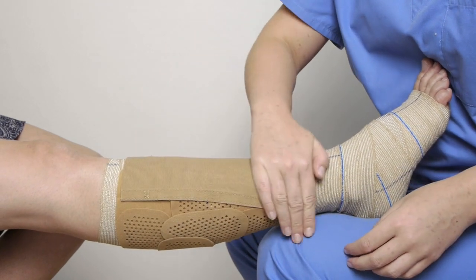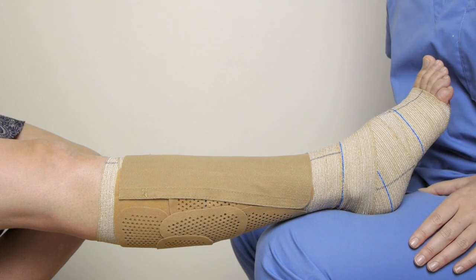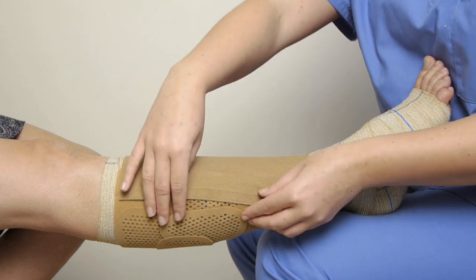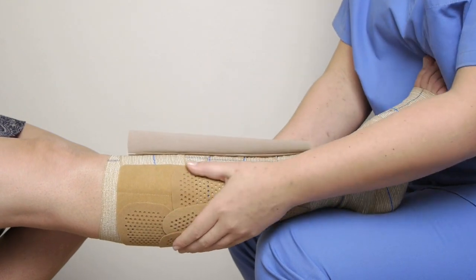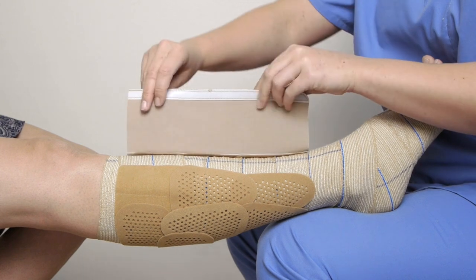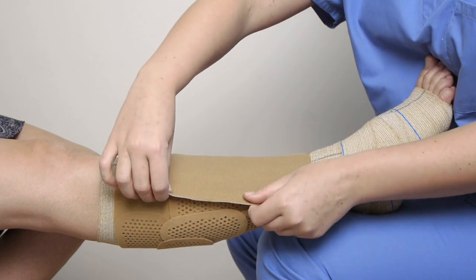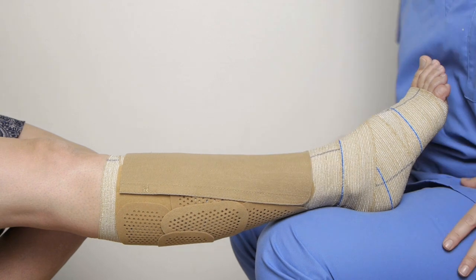To maintain the working pressure as edema goes down, adjust fix patch each morning and evening. Open fix patch at one side, and use your hands to smooth the patches around the leg so that the bandage can pull the press patches closer. Stretch fix patch slightly to remove any creases, and then close it. This easy maneuver ensures that the pressure will be maintained for 7 days.